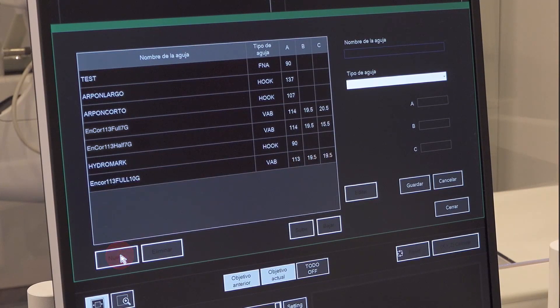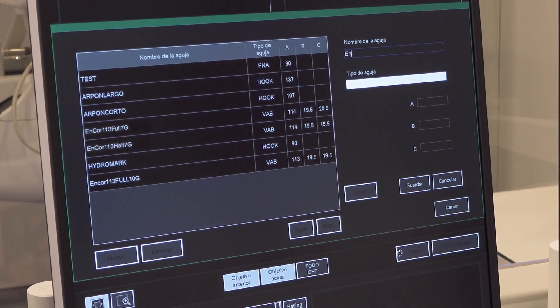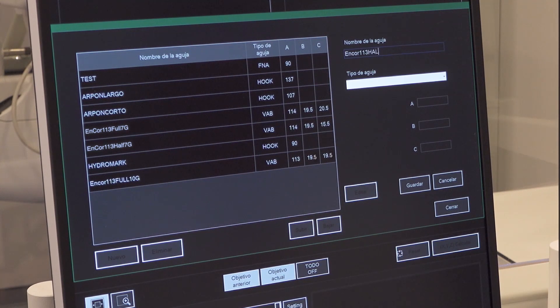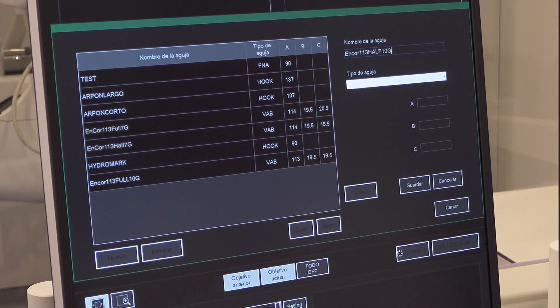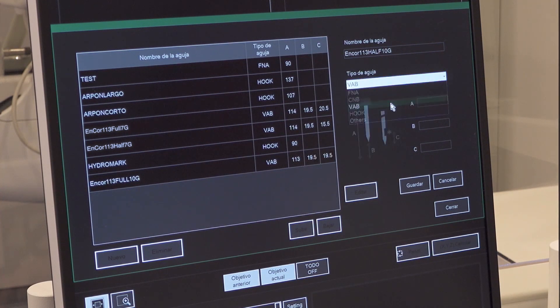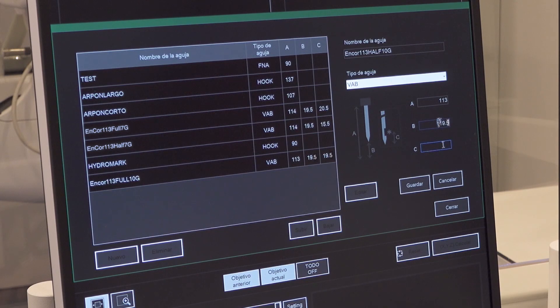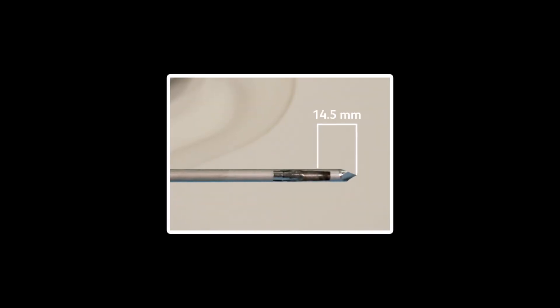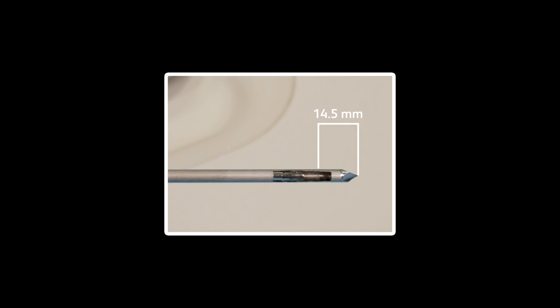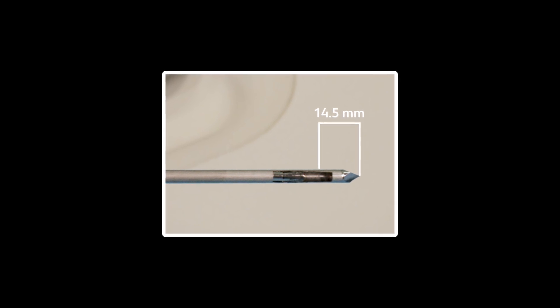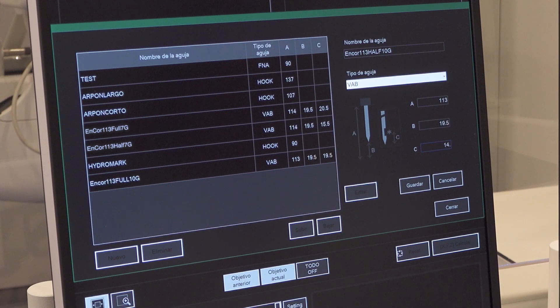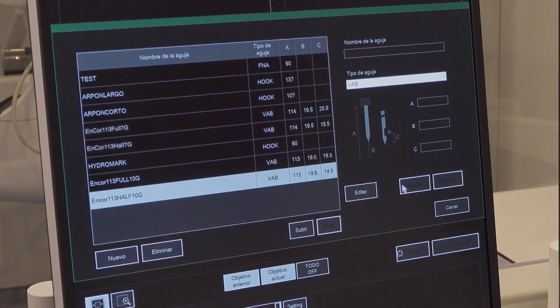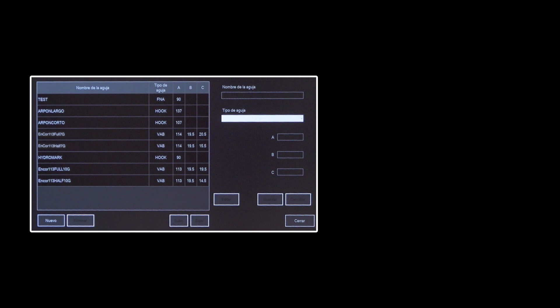Repeat the steps for adding Encore 113mm 10G half notch. Click save when done to save the new needle in the needle panel. Verify that the needles have been added to the list.